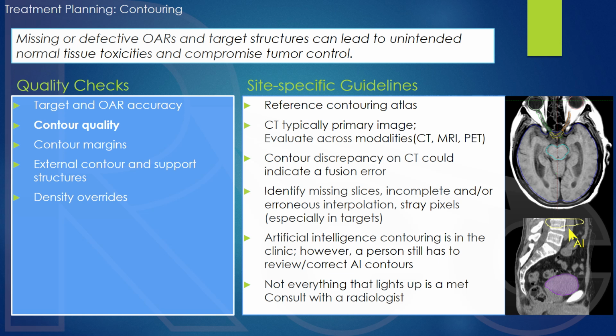It's also important to note that not everything that lights up on a PET scan, CT, or so on is actually a metastasis or a target. It's so important to consult with the radiologist for target definitions.